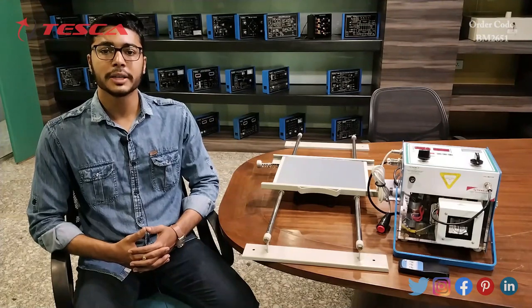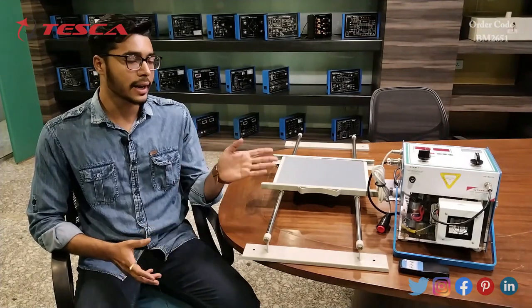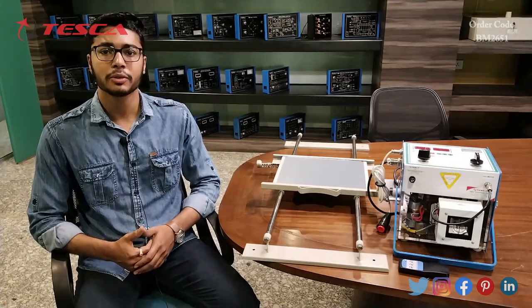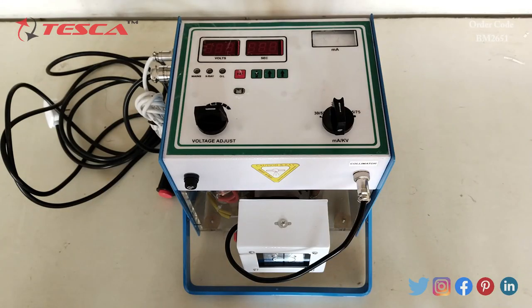Hello everyone, welcome to Tesca Technologies Private Limited. My name is Ashim Dutta, and today we are going to discuss the X-ray demo kit. Its order code is BM2651. In this video we are going to discuss its components. This is the X-ray demo machine with remote control using a microcontroller.